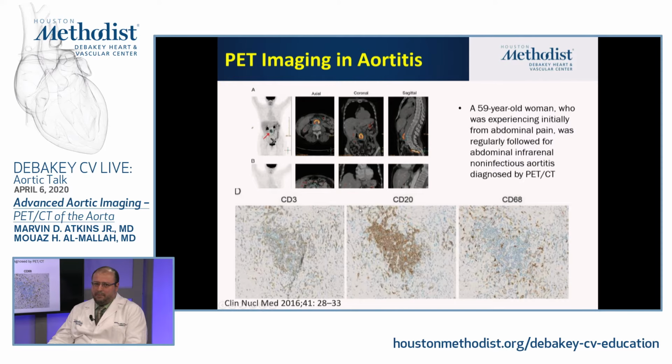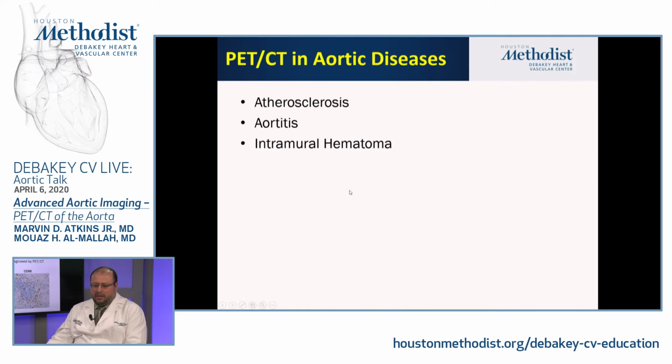Great. Now, moving on to other potential implications, going into intramural hematomas and dissections, contrast-enhanced CT would still be the way to go for these patients. Sure.